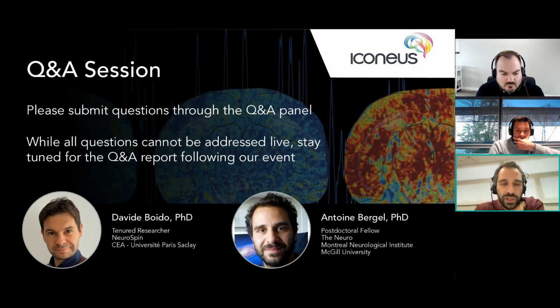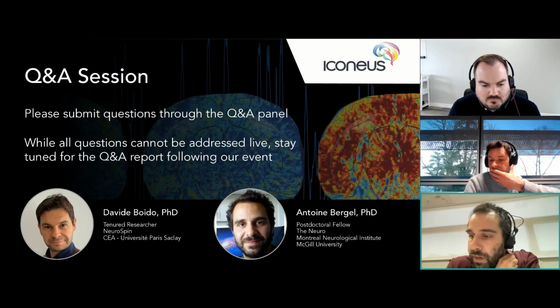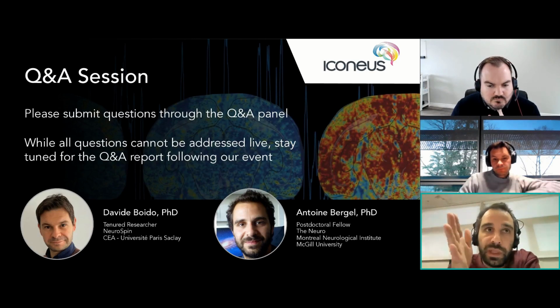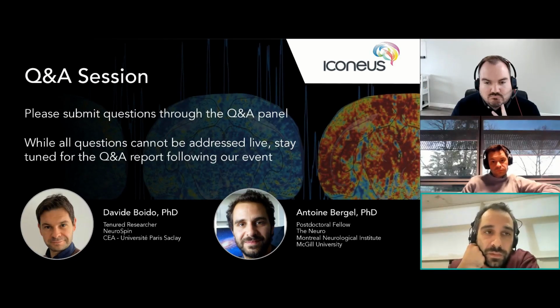Yeah, so it's a good question, and actually it's something that we cannot completely rule out. We are sending ultrasonic waves. There are biological processes at stake here, and ultrasound waves actually do modulate brain activity. So far, when the electrophysiology is properly grounded, we don't see any difference visually. And it was also important to do that approach where we would have both the probe and the electrodes on the same plane, and other recordings when we don't have that, and we don't see any change in the electrophysiology signal.